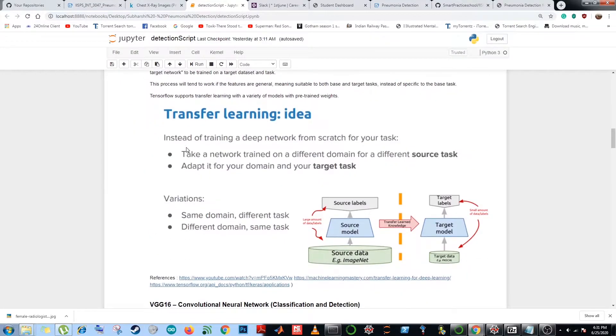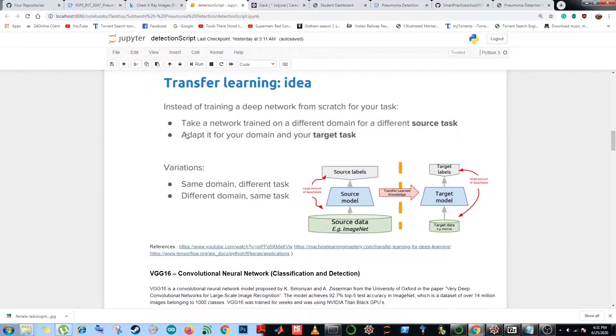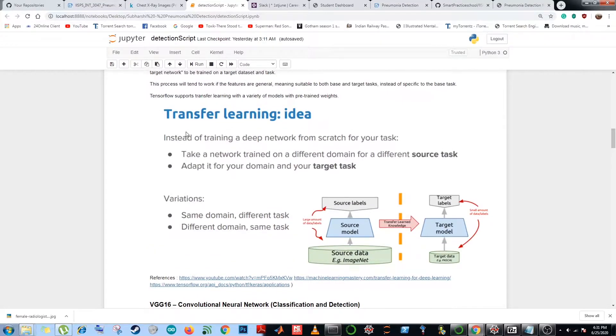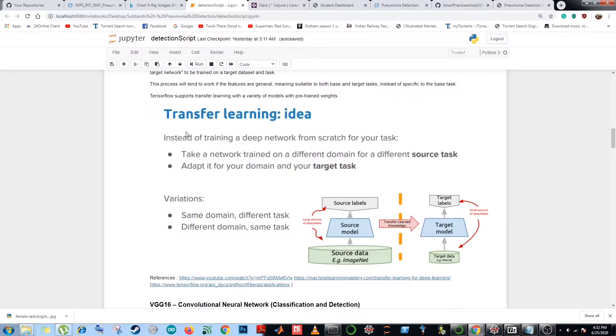Next, I would like to talk about the concept of transfer learning. Transfer learning is a technique using the parameters of a model trained on some other, maybe similar, dataset. Either we can directly use it for just making our required predictions, or we can train some of its layers to predict on our own dataset. In traditional machine learning approaches, we do not take knowledge from one learning system to another even if the datasets are similar, but in transfer learning we take the parameters from another system and can use it to train on our own dataset.